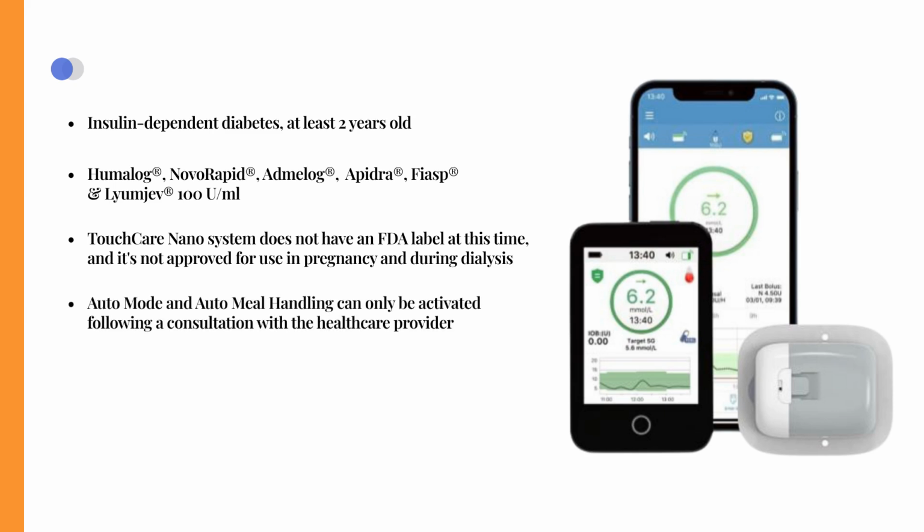It's important to note that advanced features like auto mode and auto meal handling can only be activated following a consultation with the healthcare provider. Once approved, a company representative can unlock these features within the app or PDM.